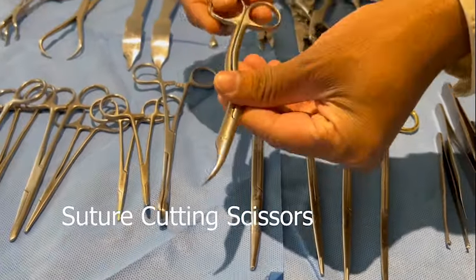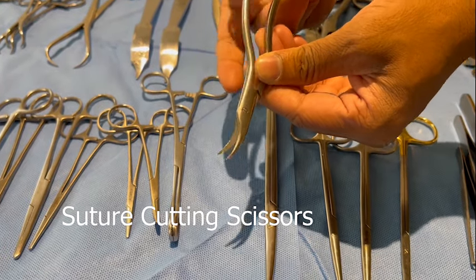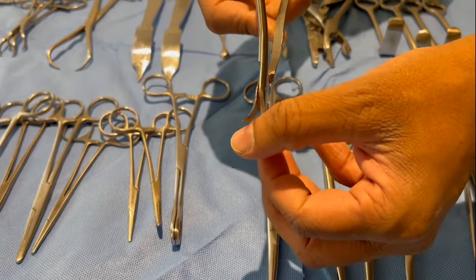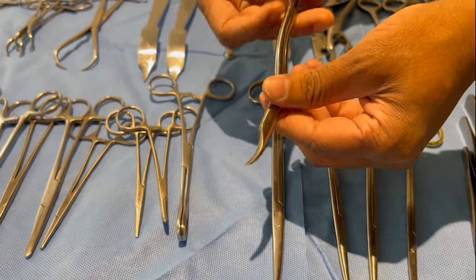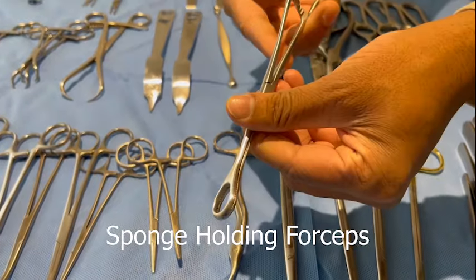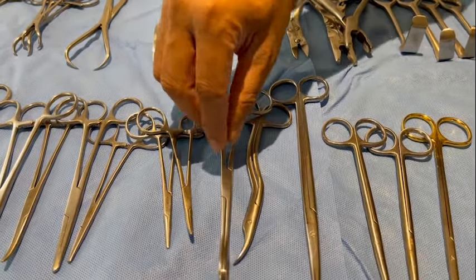This is a suture cutting scissor. The shape is specifically made like this in order to pick up the suture under one of the blades and cut it. This is a sponge holding forceps, used to pick up a sponge and for preparing the area.